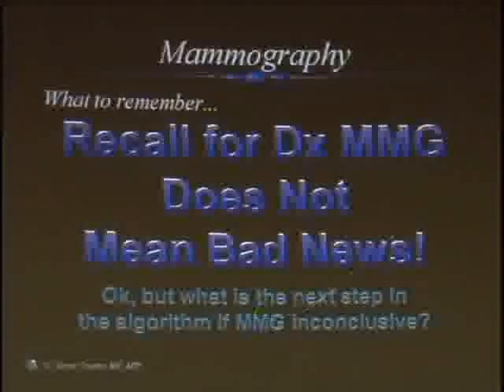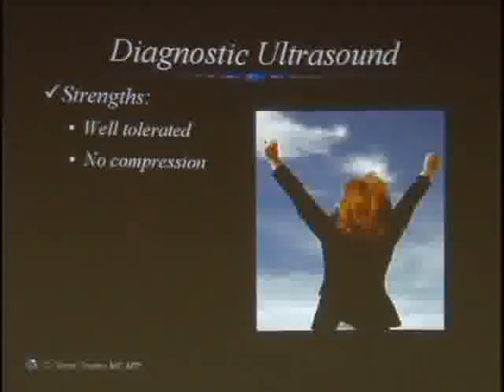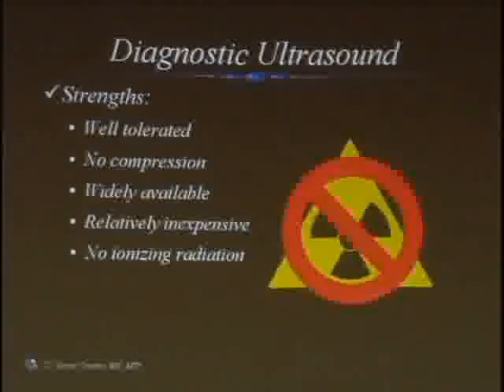Okay, so now what if the diagnostic mammogram is bad, inconclusive, we need more tests? What's the next step in the algorithm? That's diagnostic ultrasound. Okay? What are its strengths? It's very well tolerated. There's no compression. It's widely available. It's relatively inexpensive. It uses no radiation. Can't use it to replace a mammogram, which does use radiation. Be clear on that for your patients. But this doesn't happen to use radiation.